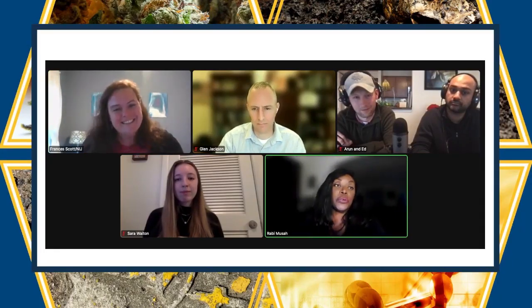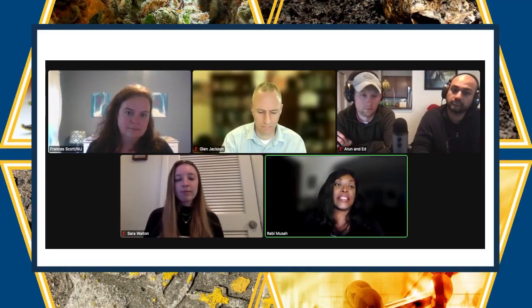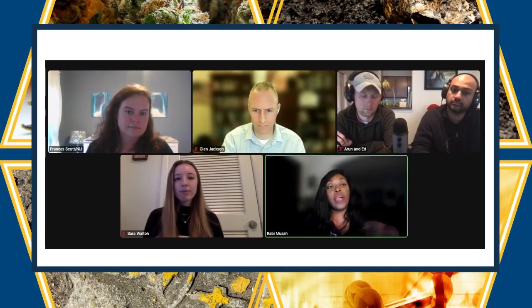So the short answer to the question is yes, but that would be facilitated actually by a GC experiment. So the idea is that the typical procedures would be followed for a drug that's coming in, right? So the gold standard is GCMS or GC. And so you would start with GC, and that would tell you that you've got this mixture. Now the algorithms that are associated with this, particularly if you perform the DART experiment under collision-induced dissociation conditions, it's complex.